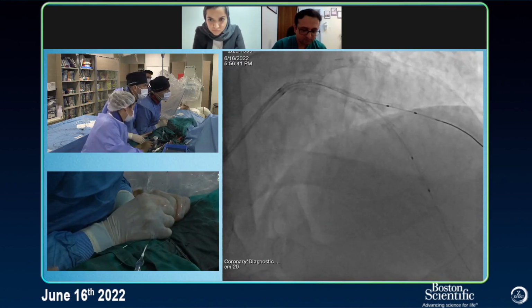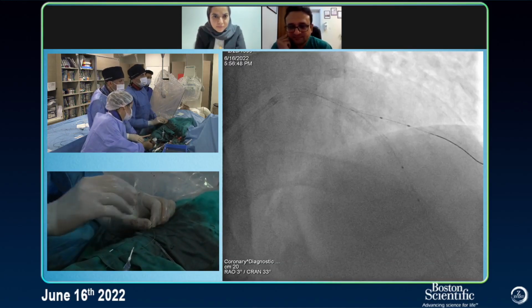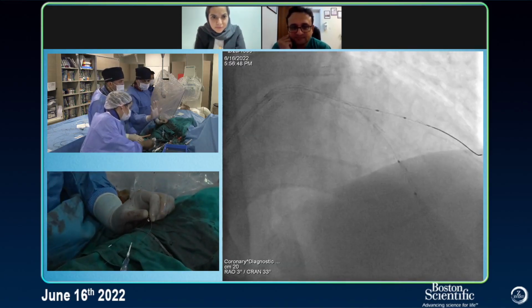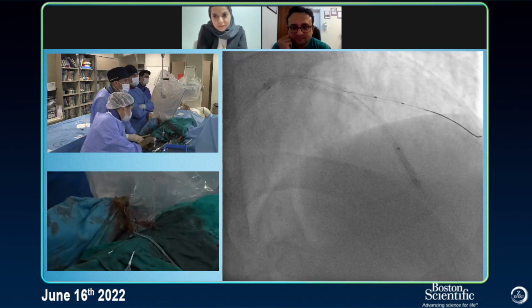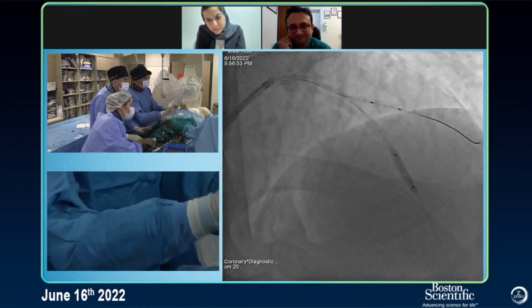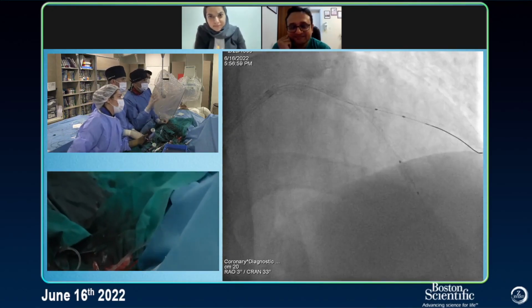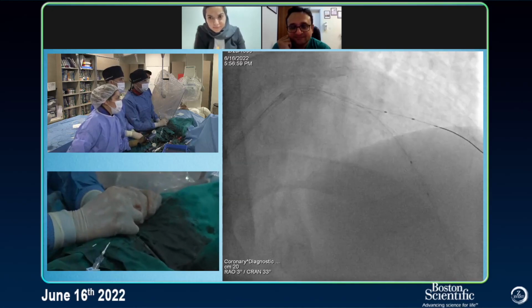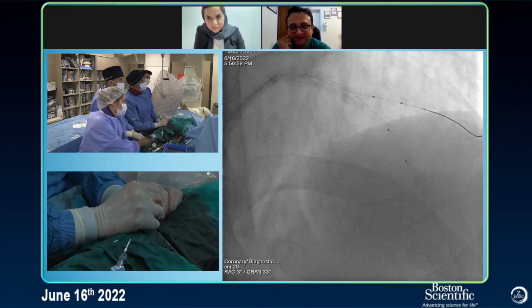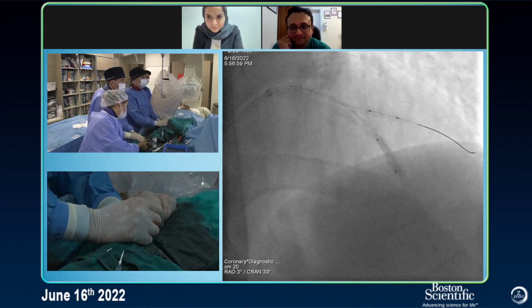Yes, it is enough. Here it is enough. Go up. Let's do small, 8, slowly. 8, 6, 8, okay, 10. 10, yes, it is enough. Stay. Down. Let's see. It became bigger. Let's see what happened. Go up here. 10, 10.